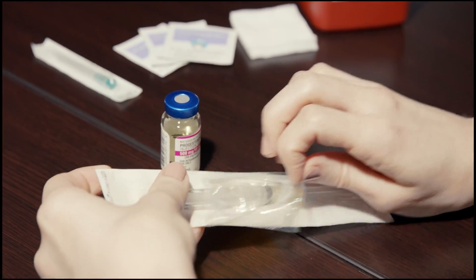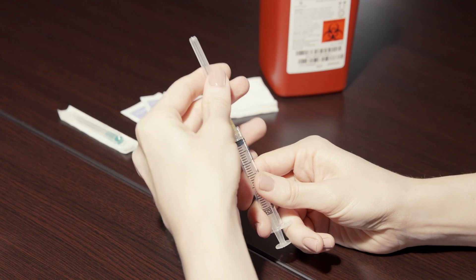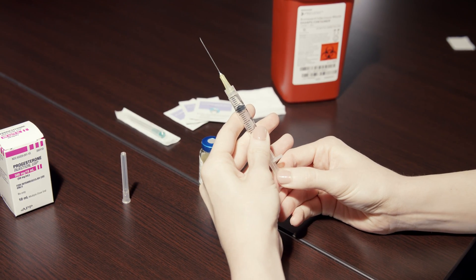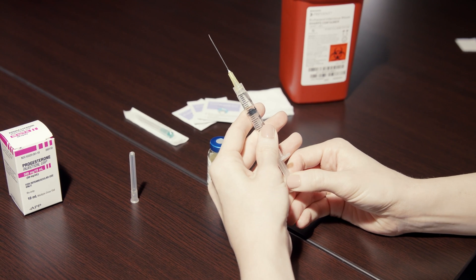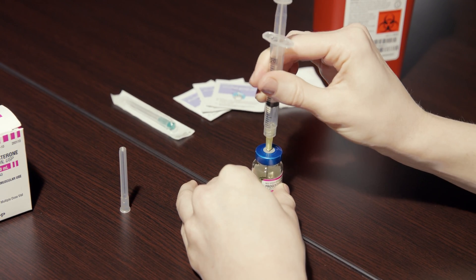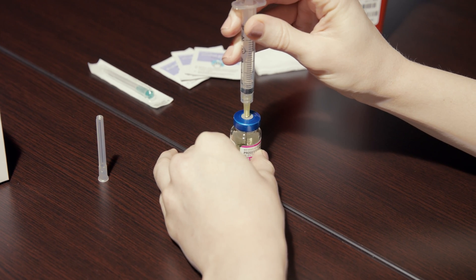Take the needle and syringe out of the packaging. Remove the cap from the needle and pull the plunger back to the selected dosage amount your physician prescribed. Place the needle into the rubber stopper on the vial and press down on the plunger until all of the air transfers into the vial.